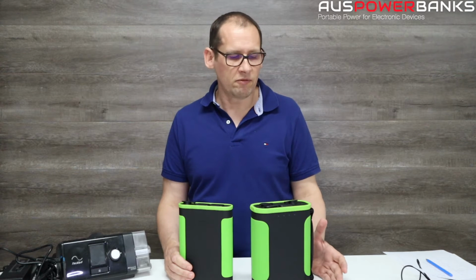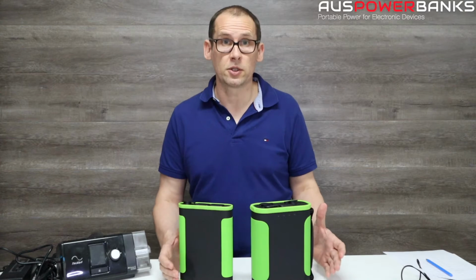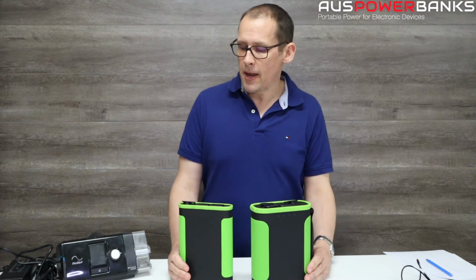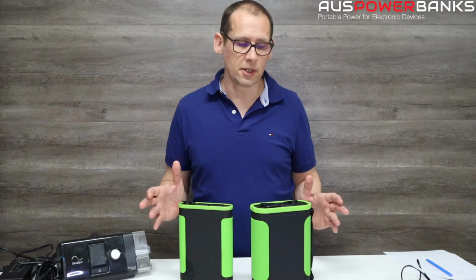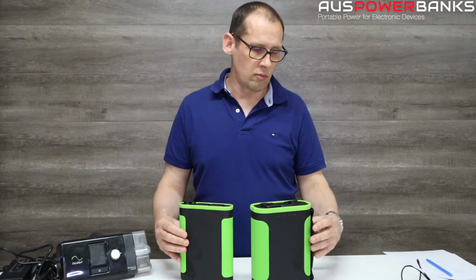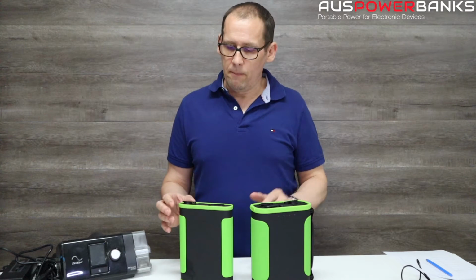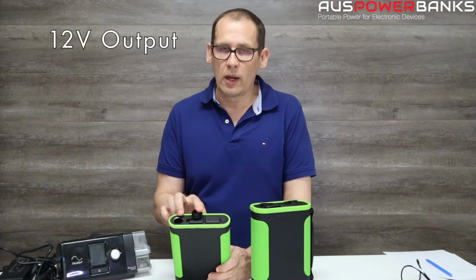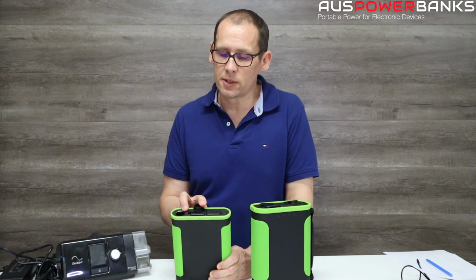So we thought we'd do a quick video just to answer some of those basic questions that we get asked a lot. We've got two power banks here that are suitable for travel, and when I say travel, they're a little bit more durable. They've got rubber around the outside, so good for camping, outdoors, that sort of thing. But both of them will have a 12-volt output. Now this is quite important when it comes to CPAP machines.